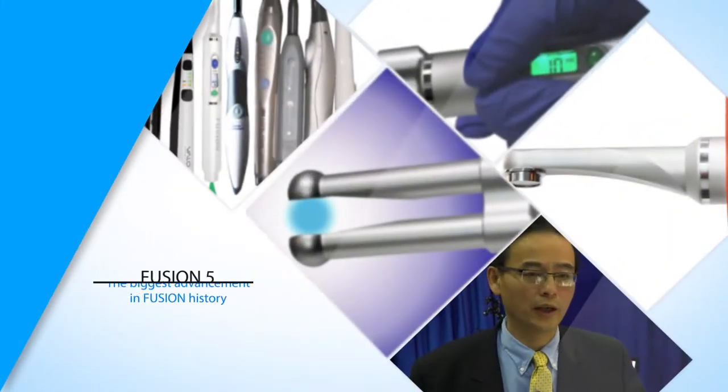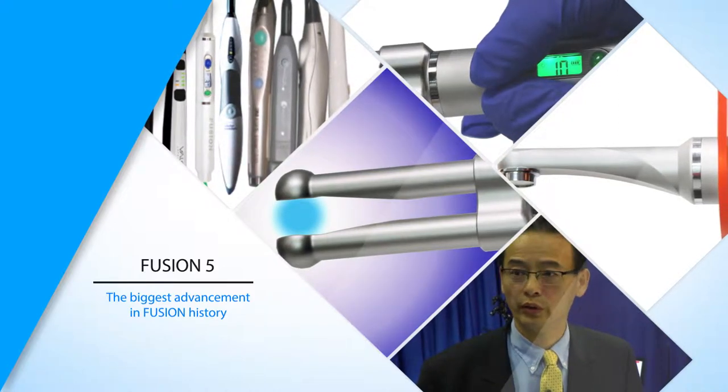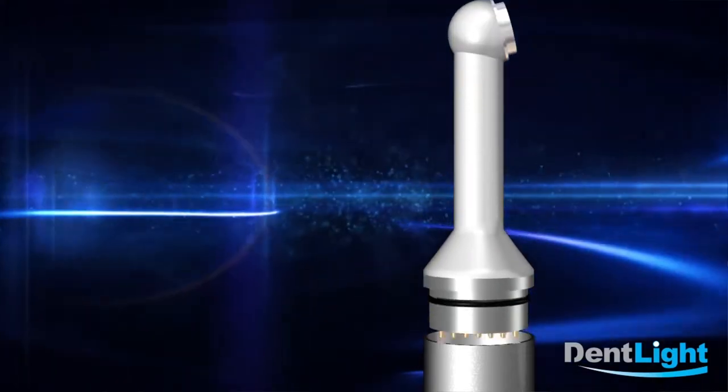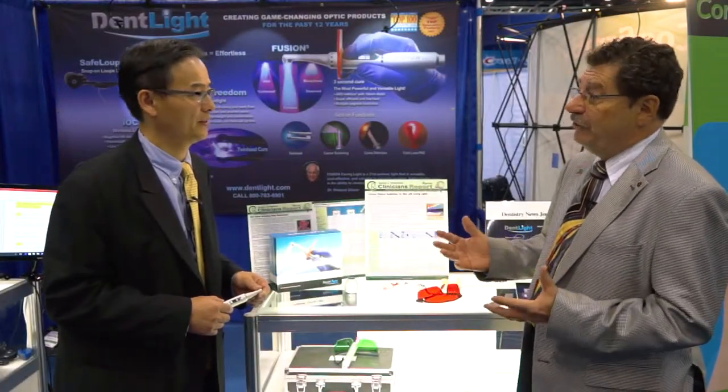We are introducing a line of products based on the Fusion 5 curing light. This light was released last year but we are adding a whole lot more new add-on heads for new functions and performance. There are so many curing lights in the dental field — what makes the Fusion 5 different from all the others?